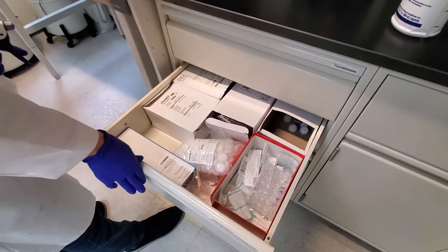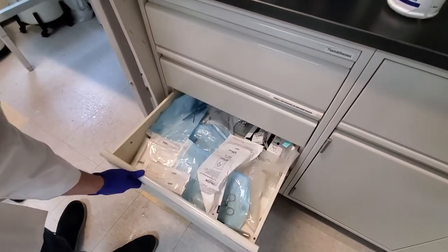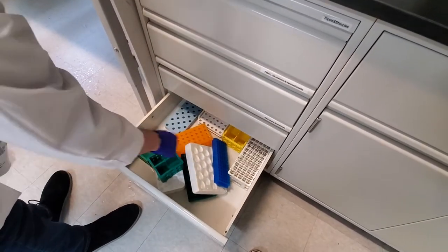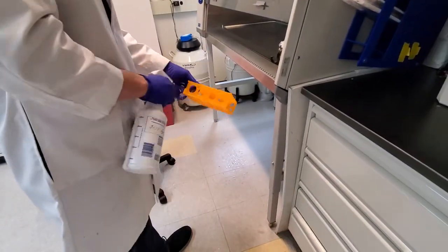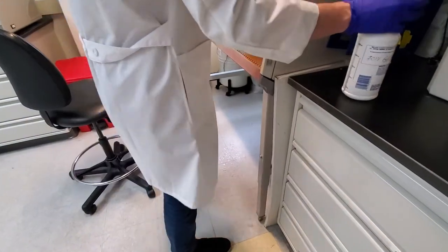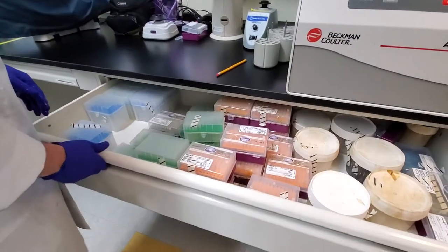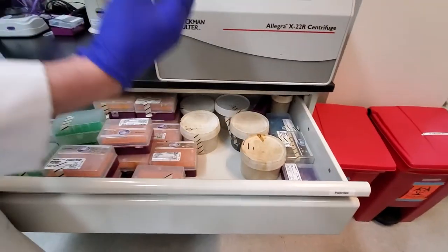Here are cell filters. We need to filter anything for different things. These are different tips and tools. We probably use this as tube holders, and different holders. Get a holder for this, put it in there. Pipette tips for tissue culture are in here. Let's get some P200s and P1000s and tissue tubes.